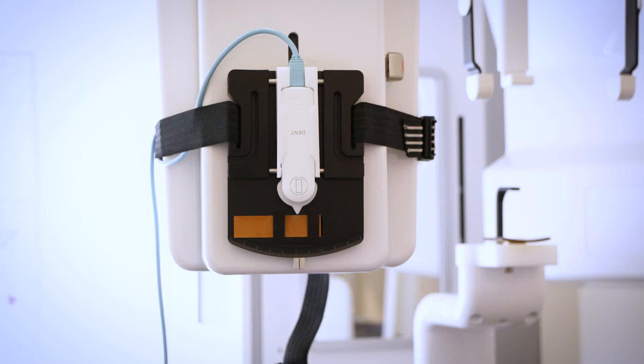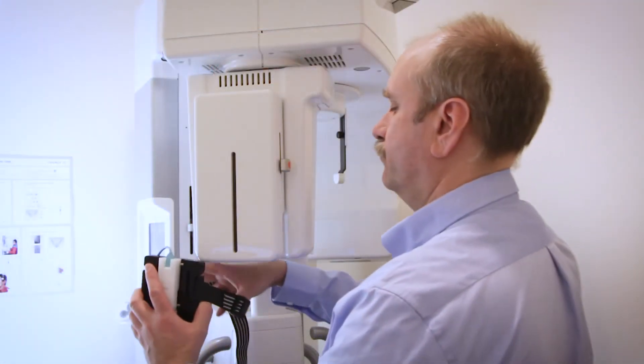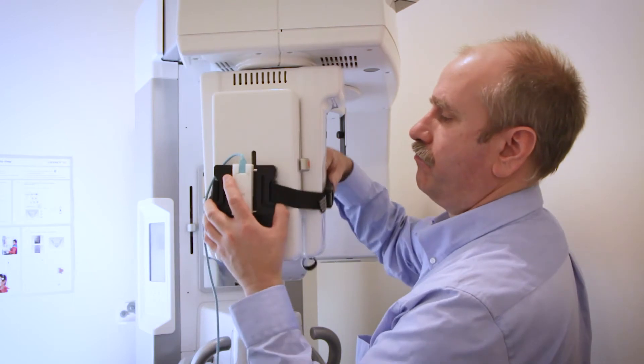The position can be sensitive down to 0.1 millimeter. The Raysafe X2 panoramic holder is a helpful tool for accurate positioning in a difficult measurement setup. Place the sensor in the panoramic holder and fit the holder on the machine.